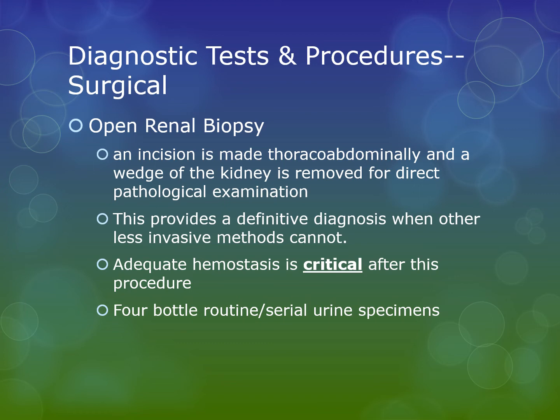When you finish with this surgery, one of the most important things to do is get adequate hemostasis, because when you're taking a chunk out of the kidney, you are literally cutting into several of those nephrons, which we all know, that's circulation. You've got afferent arterioles going into every one of those nephrons. It's going to bleed. So you need to make sure you get adequate hemostasis. We'll use some surgical fiber that's treated with thromboplastin and try to use those things to stop the bleeding.